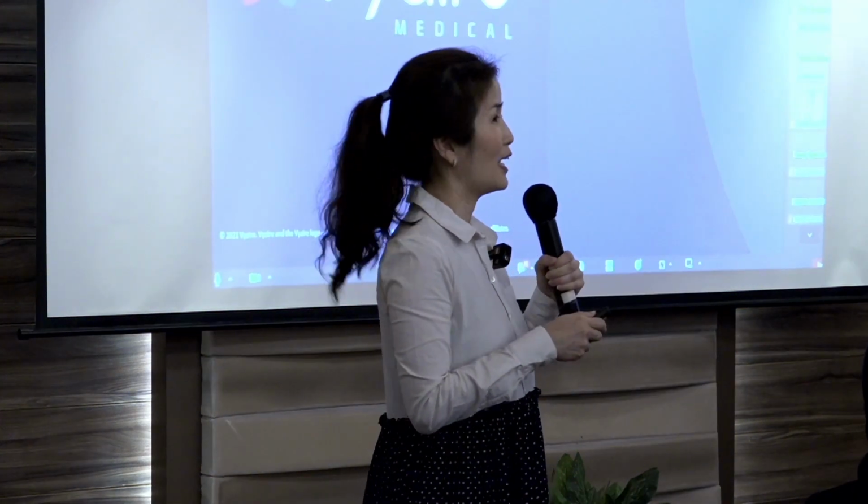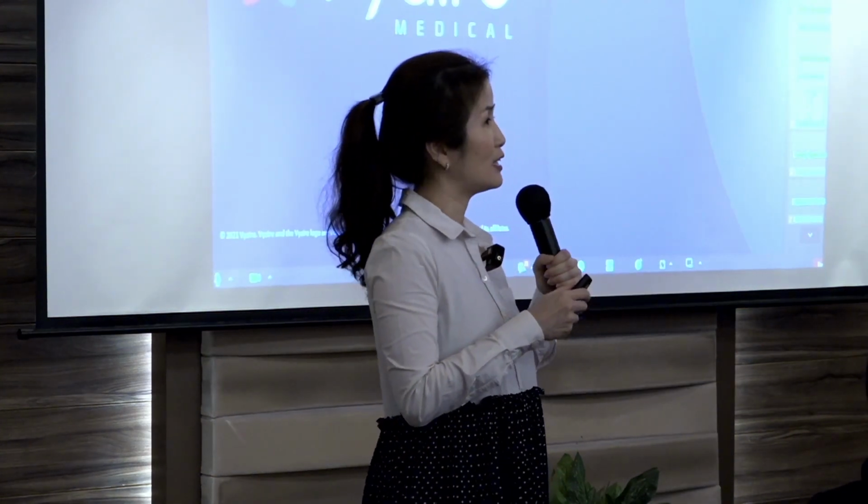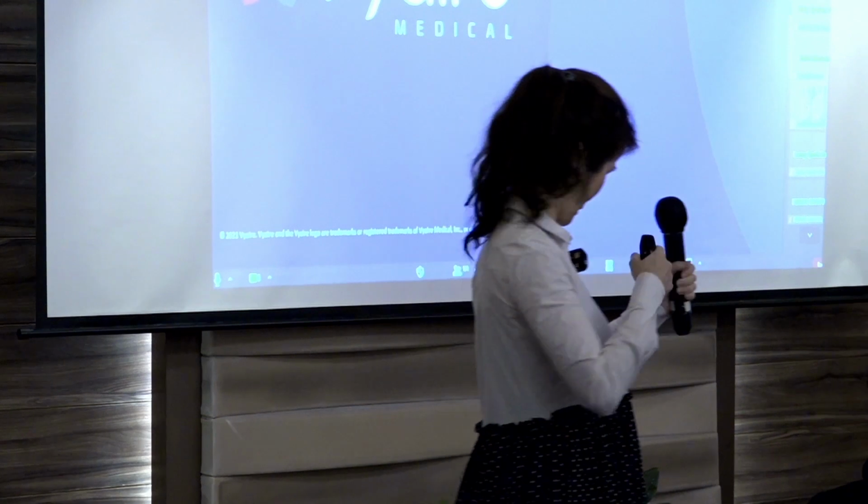Even though the patient is having spontaneous breathing, it still allows us to monitor the patient's lung compliance and conditions at the volumes that we do have. It is also easy to use, as it's just available on the ventilator itself. You do not need additional equipment. That's all. Dr. Adi, do you want to do the summary?